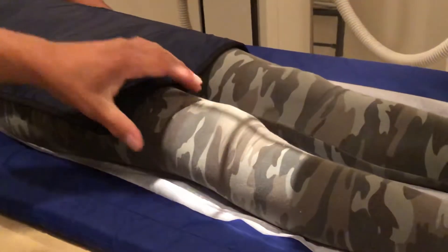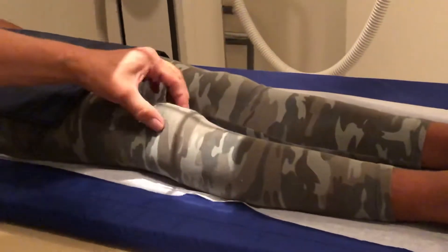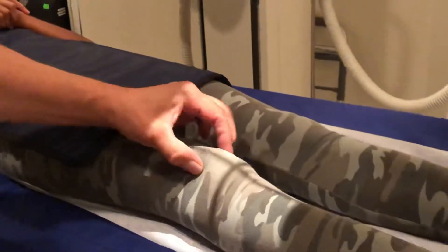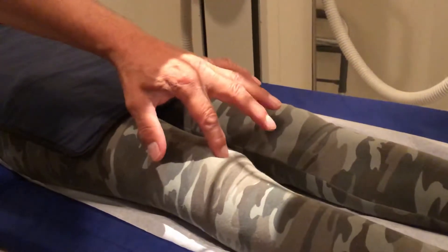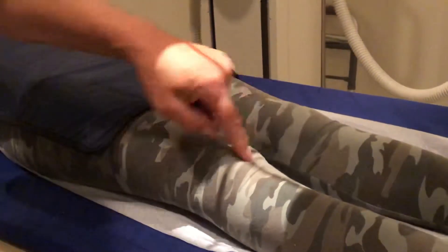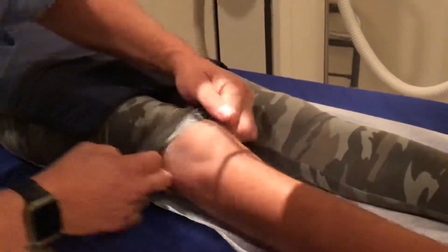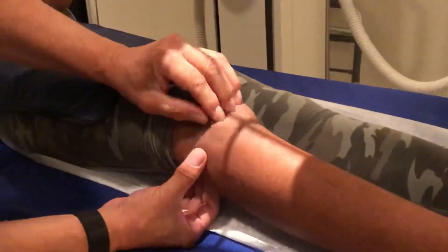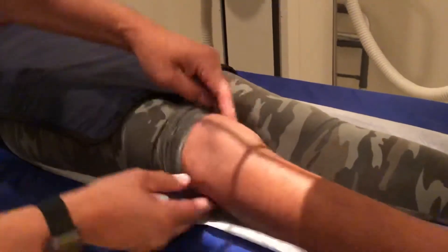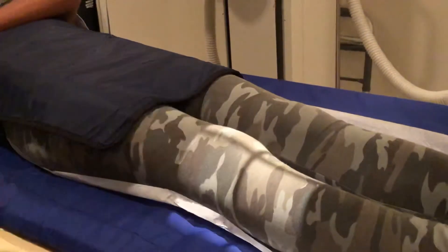For the AP, you're going to want to point the toes up towards the ceiling, make sure everything is truly AP, and then with your finger you're gonna feel for the kneecap. You're gonna go down to the end of the kneecap at the apex and then go a half inch below that — so you want to center about right there. Here's the kneecap, the bottom of it, and you're gonna center right there. And that's your AP.